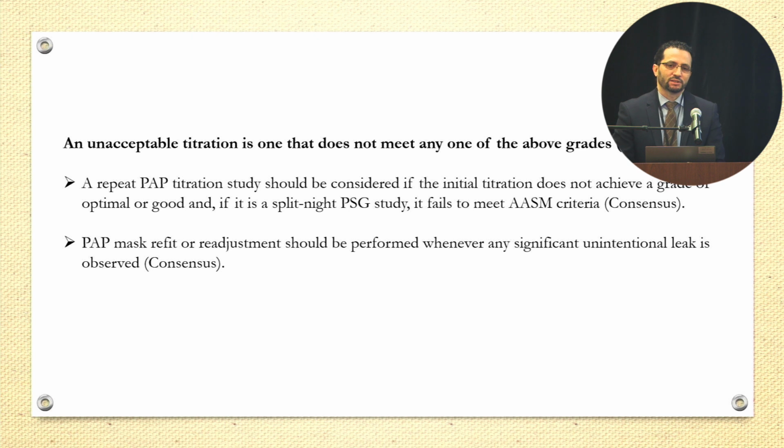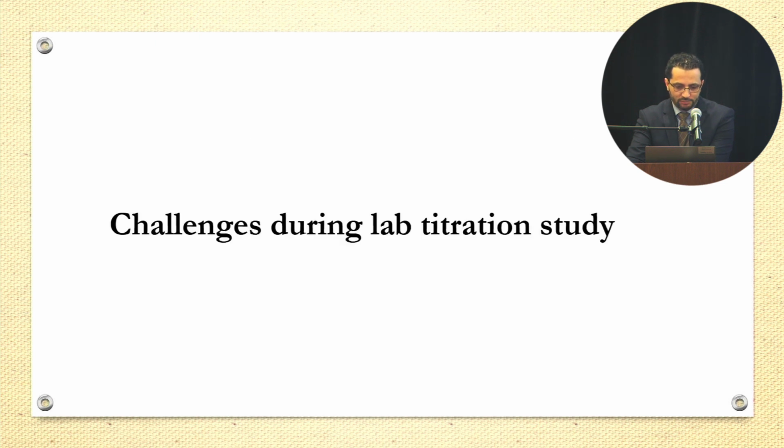Unacceptable titration, who doesn't meet any of that? In that case, you need to repeat your PAP titration, or you need to look for something else. So that's when everything went smoothly, and you got the pressure that you needed for your patients.